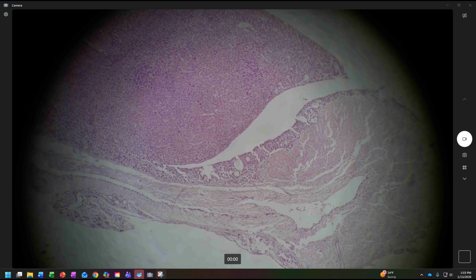I can't show the whole gland to compare size. It doesn't say if this is human or not, probably is. But either way, we've got this large, dark, grainy area and this lighter, wispy area here. That's our ding, ding, ding that we're looking at a pituitary gland.